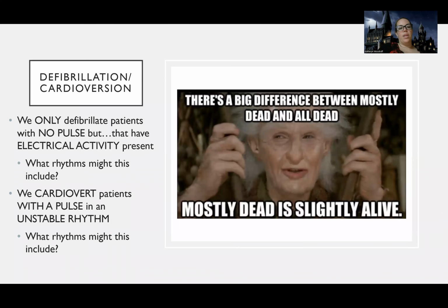So let's talk about defibrillation and cardioversion. Just to clarify, because I did kind of go over this, but I want to make sure it's clear: we only defibrillate or shock patients that have no pulse, but that have electrical activity present.